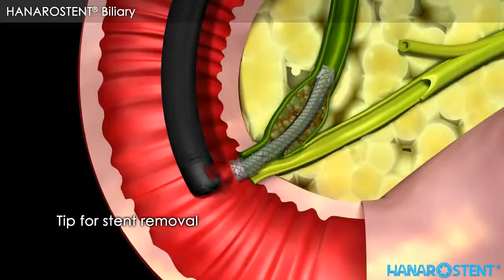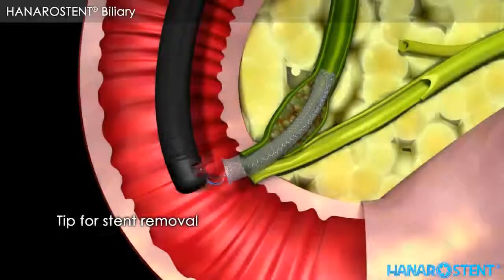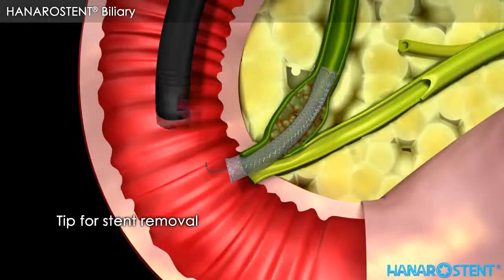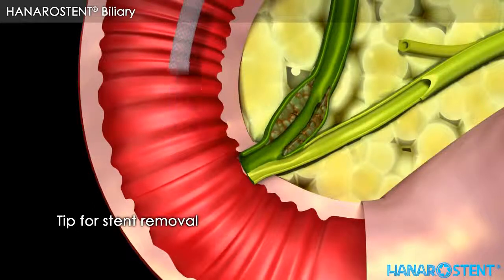Here are tips for stent removal. Use a snare, pull the long lasso and invert the stent, or pull the short lasso.